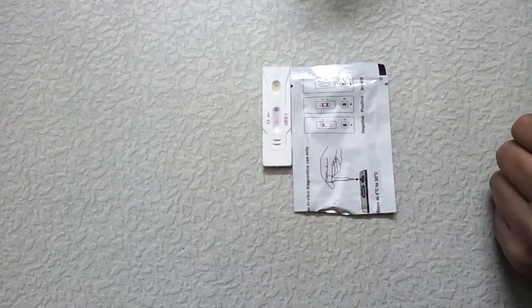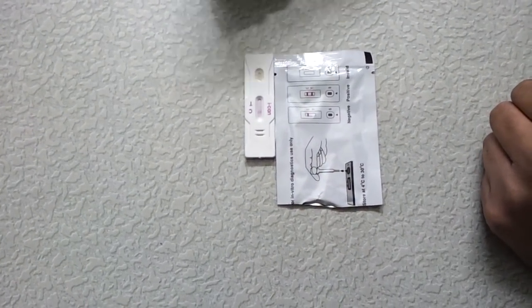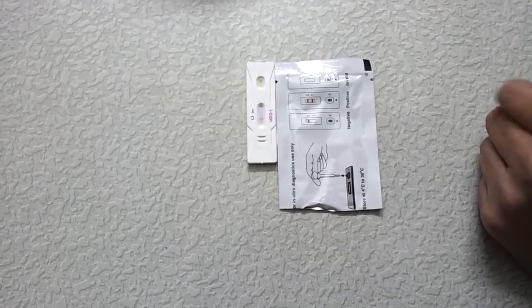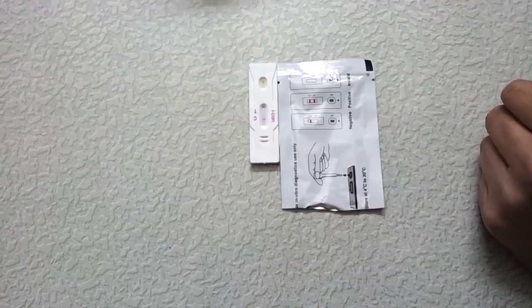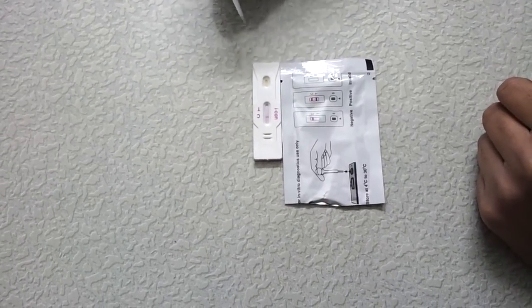Either the device is expired or you have not taken the samples well. So as you can see, there is only a single dark line, which means the results are negative. And hence, whosoever urine sample I have taken, she is not pregnant.